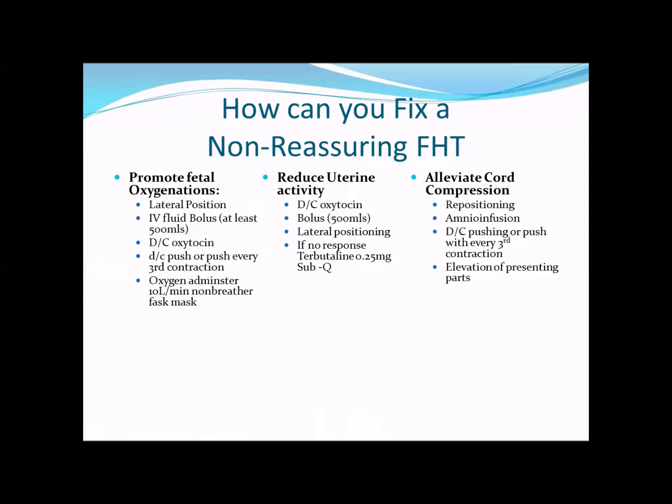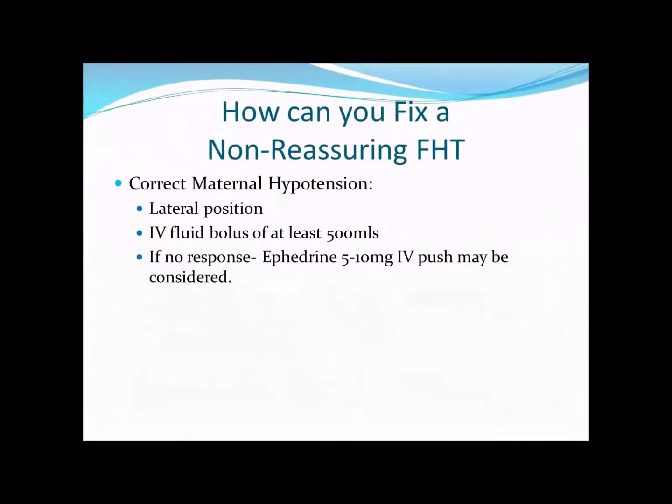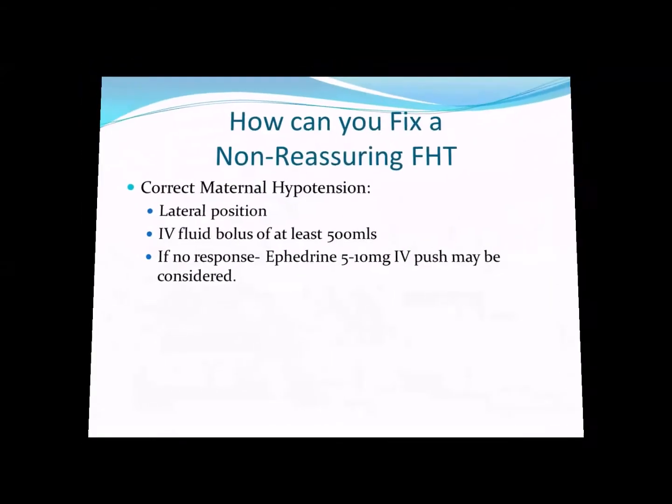Okay, so that's why we don't really like to mess around with moms having their water broken at home and just being at home. We really want them to come in and be seen because we're medical and we want to see what that baby's doing. So if we're thinking cord compression and positioning and amnio fluid infusion, if that's not helping that cord compression, then we're probably going to end up going to a category 3 strip and we're going to deliver that baby. Okay. So we already talked about that.